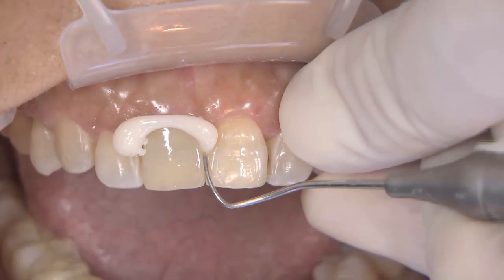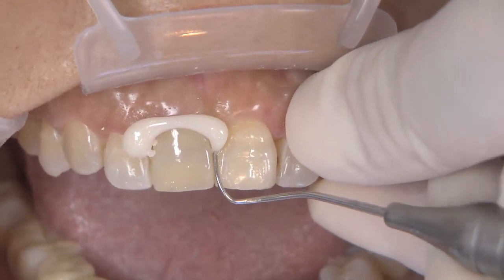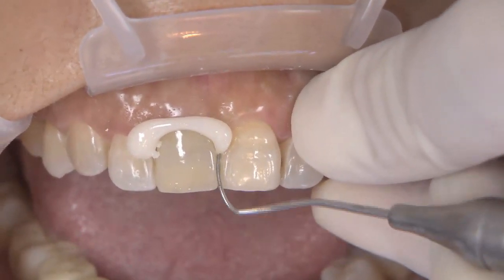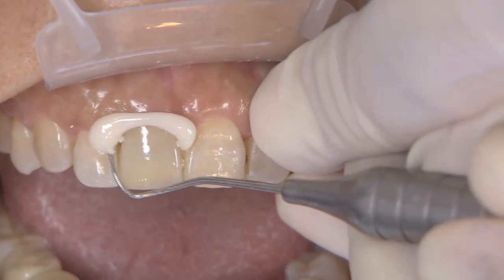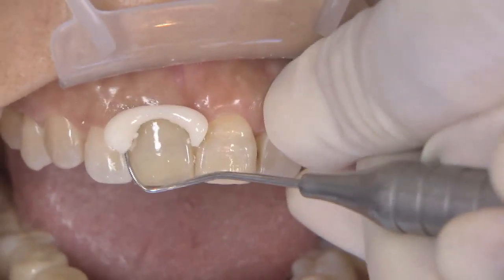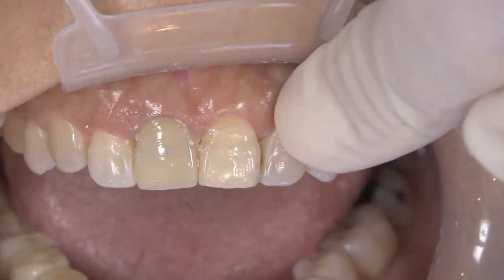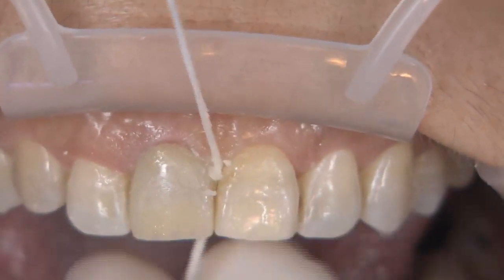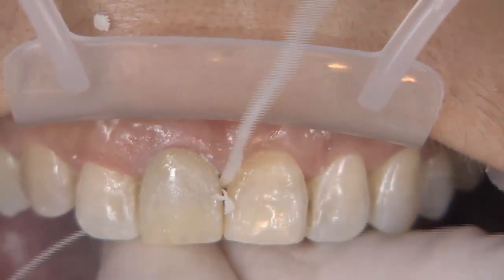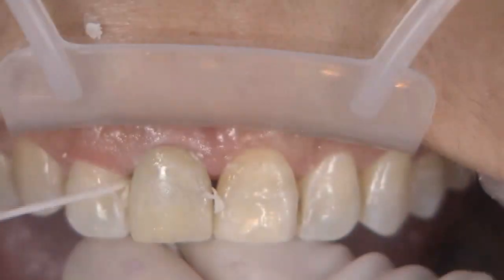It's a nice feeling to be able to slide your explorer underneath it and peel that away — feeling like you got all the cement off, and it was simple and straightforward. You could wait for this without doing any light curing and it doesn't take a real long period of time. We put that crown in, I cured it for about a second, checked it and it was still just a little bit soft, then hit it one more time for about another second. And so we're cleaning it up immediately. With most resin-modified glass ionomer cements, you're putting the crown in and it's two or three minutes before you clean it up, and if you wait a little too long it's going to be hard as a rock. So it really is nice to be able to cure it, activate it with the light, and start cleaning up the margins.